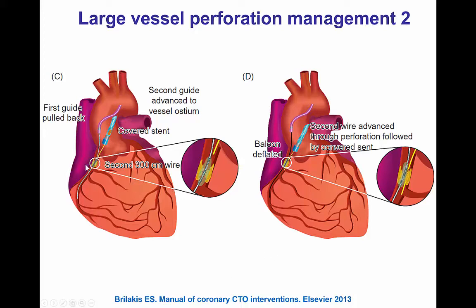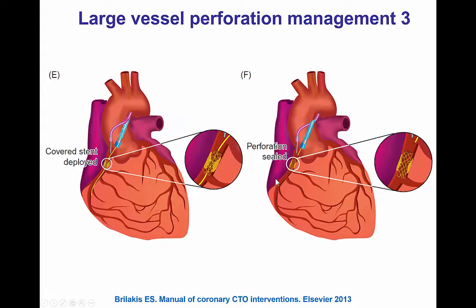Here's an example of the dual guide catheter technique. The perforation happened and a balloon is inflated through the first guide catheter to seal the perforation. Then a second guide catheter is advanced into the vessel ostium and a second guide wire is inserted past the area of perforation. Then the covered stent is delivered, the first balloon is removed, the covered stent is deployed, and that leads to sealing of the perforation.